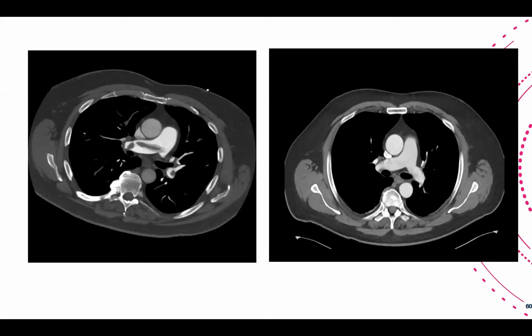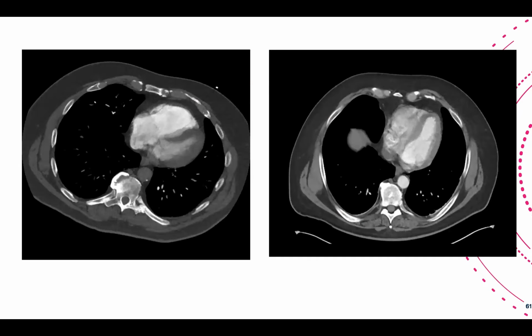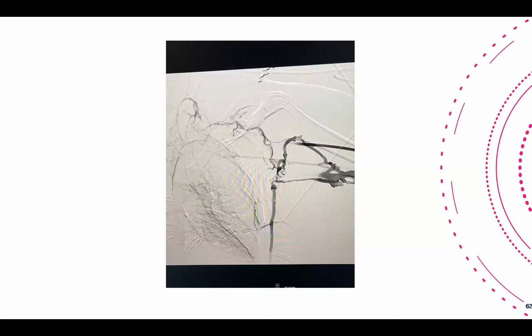We normally do a baseline scan, and this shows bigger clots in the main pulmonary artery and subsegmental branches. This is the second day exam after the treatment. So almost complete resolution of the clots. And you can also see the difference in the RV-LV ratio. It's a big difference.